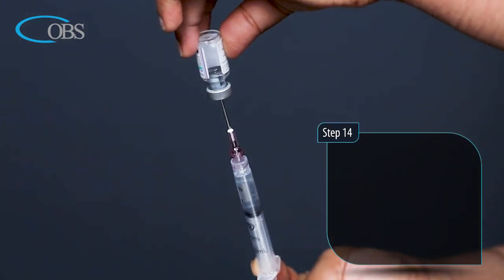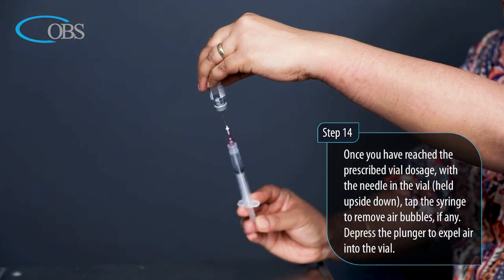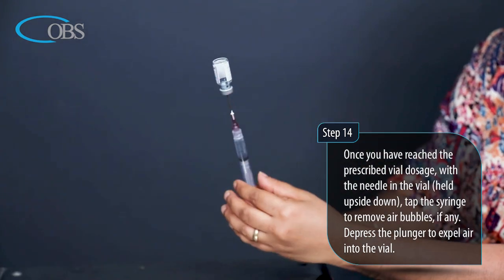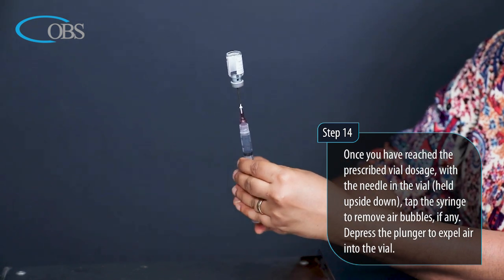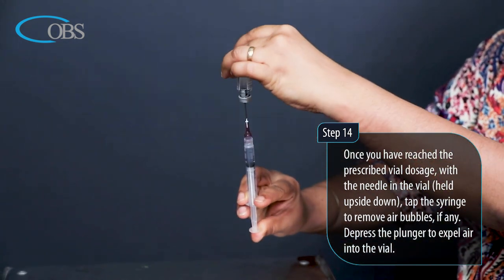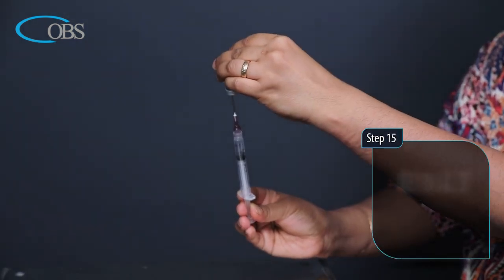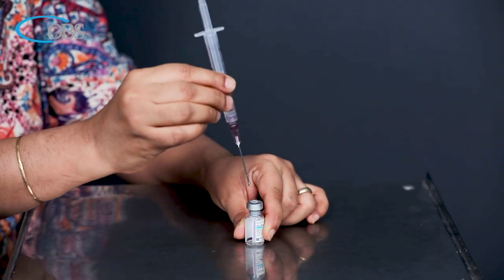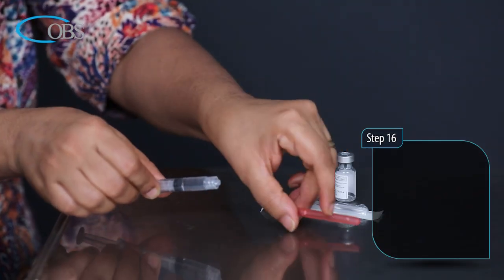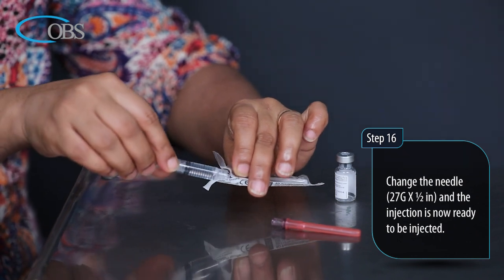Step 14: Once you have reached the prescribed vial dosage, with the needle in the vial held upside down, tap the syringe to remove any air bubbles. Depress the plunger to expel air into the vial. Step 15: Turn the vial upright and remove the needle. Step 16: Change the needle to 27 gauge thickness and half inch length.